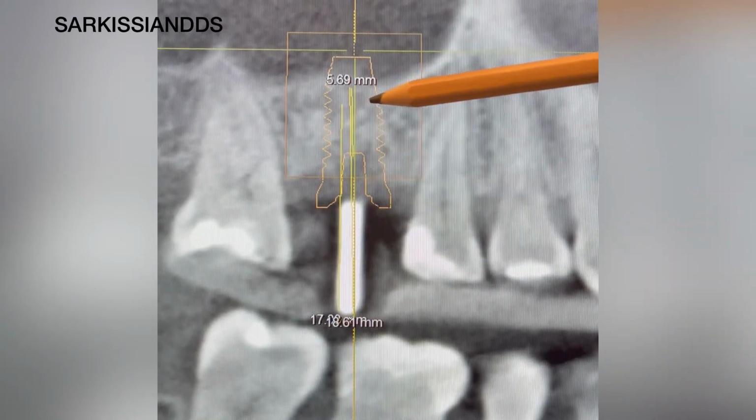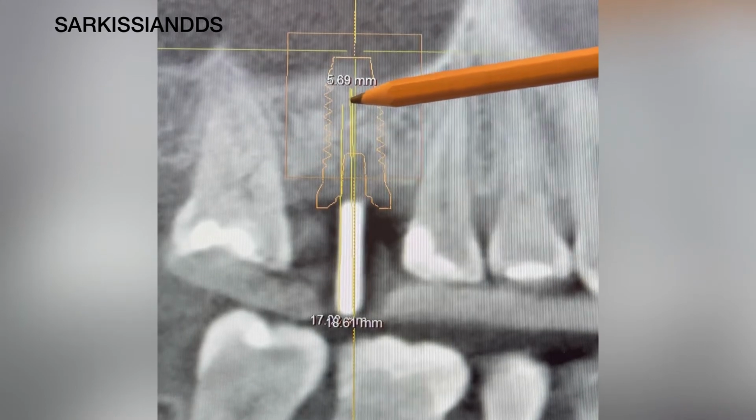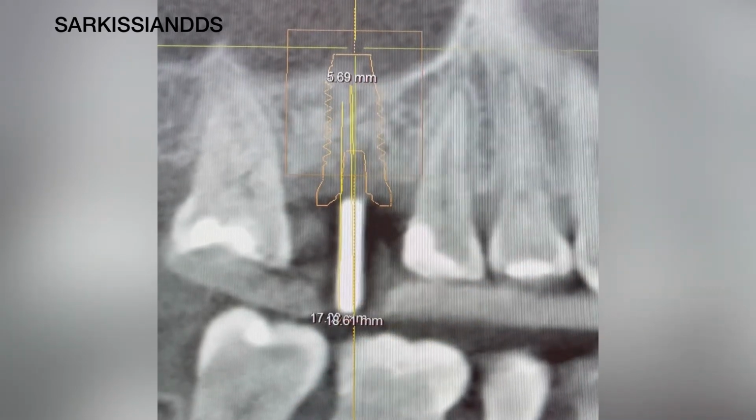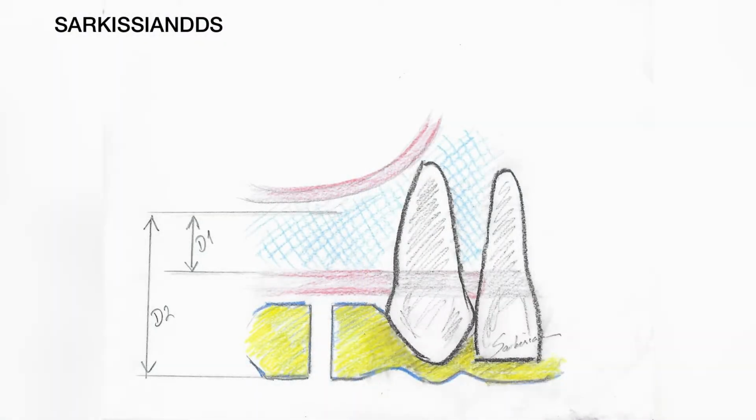I meticulously measure my depths. To be able to punch through the bone plate, I will need to stop 2 millimeters short of the sinus floor. If I go deeper, I may perforate. The D2 value measured here is measured from the top of the surgical guide to the osteotomy endpoint, which is carried out only with a pilot drill.